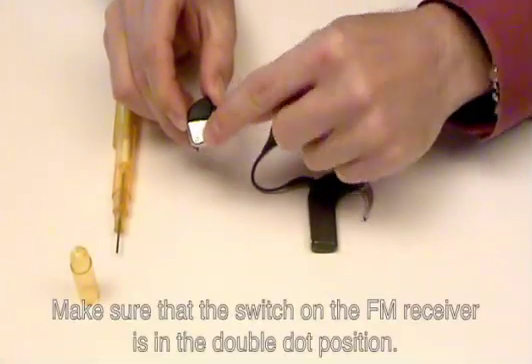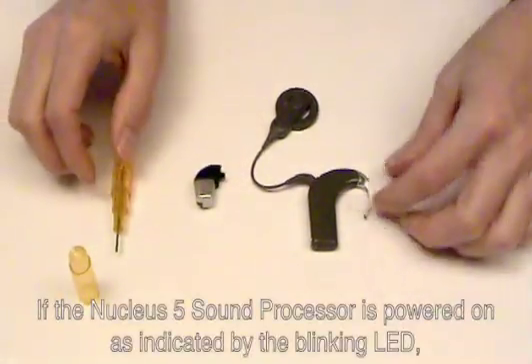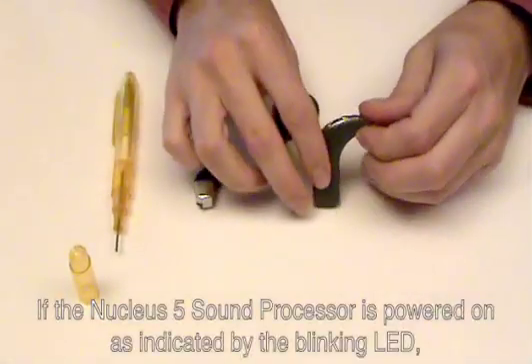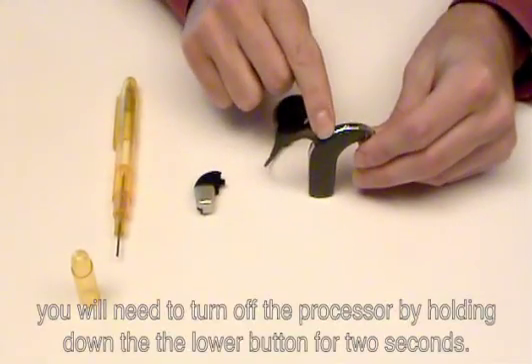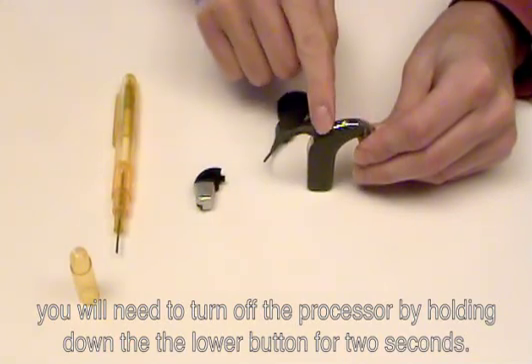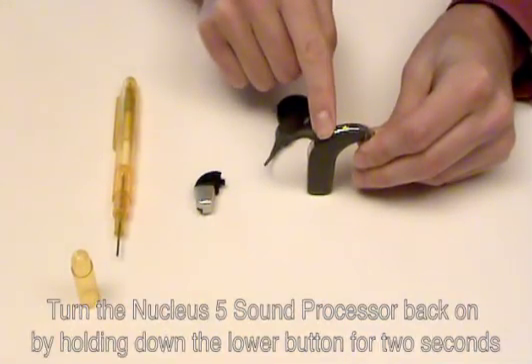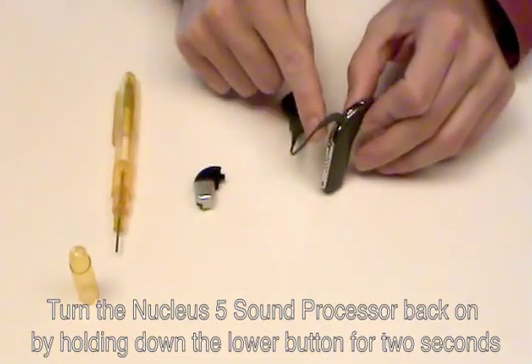Make sure that the switch on the FM receiver is in the double dot position. If the Nucleus 5 sound processor is powered on, as indicated by the blinking LED, you will need to turn off the sound processor by holding down the lower button for two seconds. Turn the Nucleus 5 sound processor back on by holding down the lower button for two seconds.